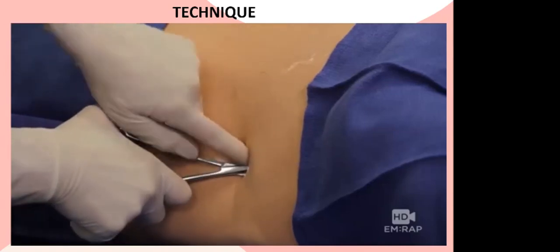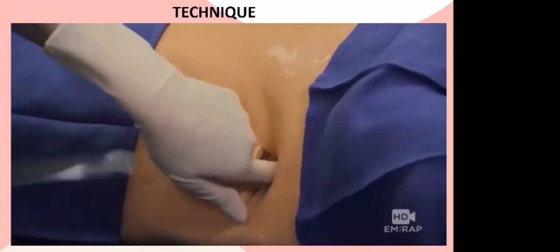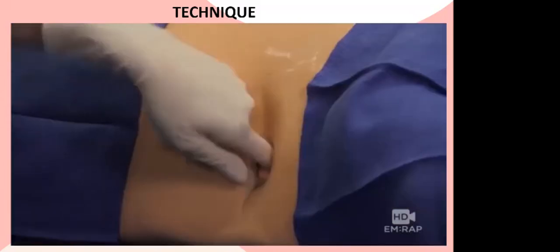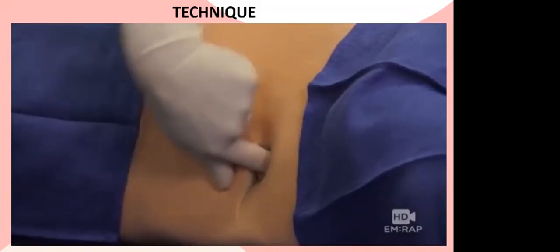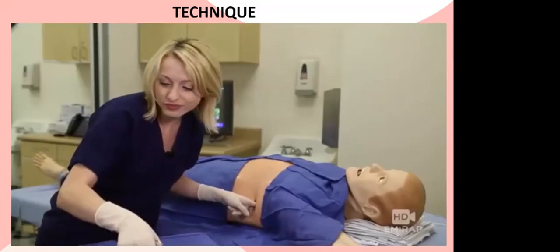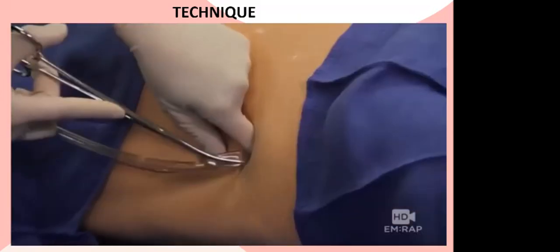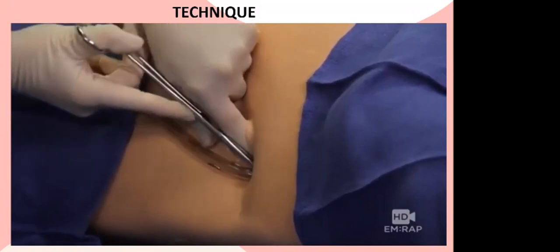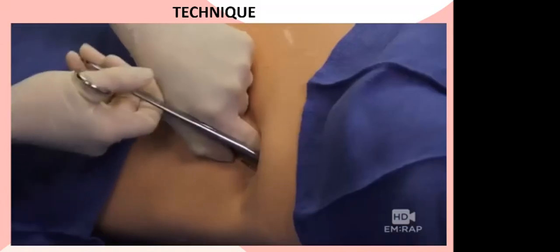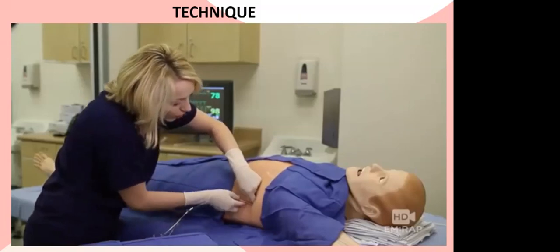Spread the Kellys open to create a hole in the pleura and insert your finger. Withdraw the Kellys. Now, I want you to feel right now, in this moment, that you are in the pleural space. So feel the inside of the ribs, feel the lungs, feel for adhesions. That's in, for sure. Now we can take our chest tube, and we're going to insert it supero-posteriorly towards the apex. Guide it along your finger and insert it until the last hole is all the way in.